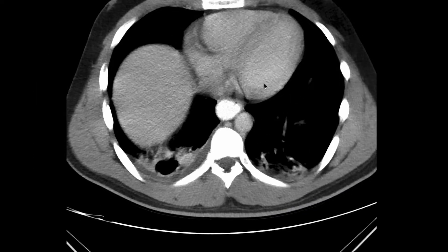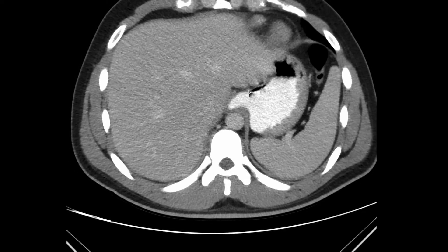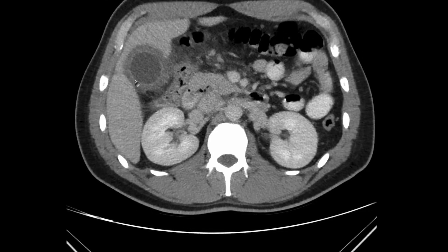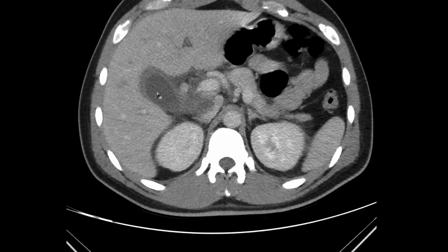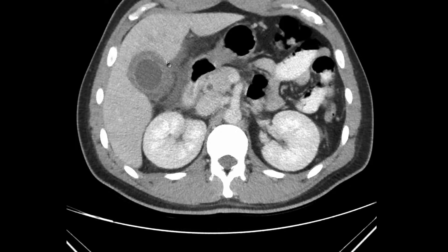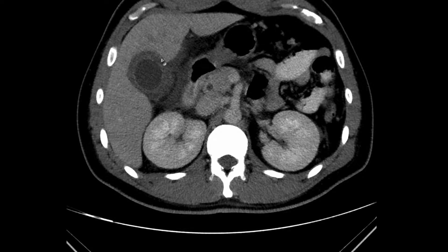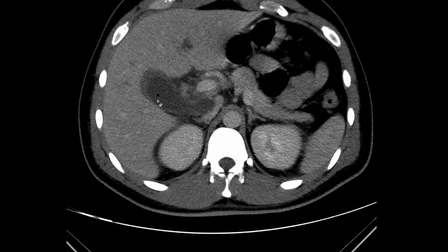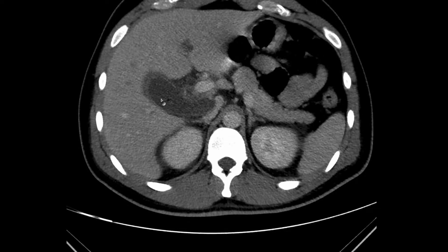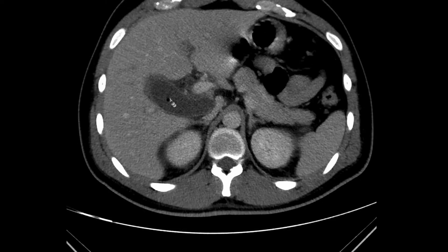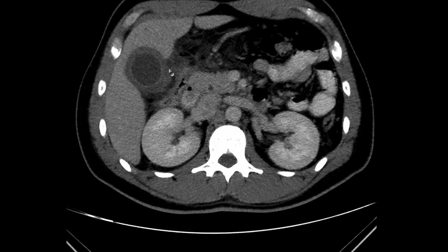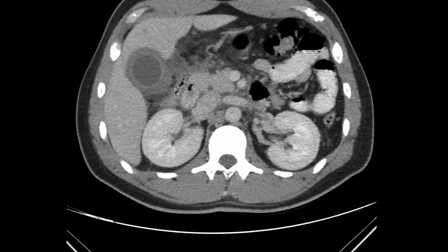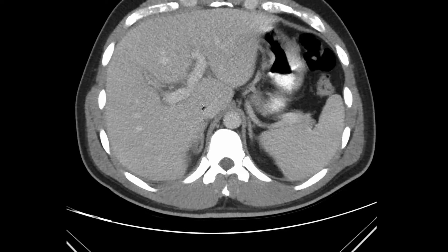Let's look at another case. This patient is a 37-year-old presenting with right upper quadrant pain. As we scroll down, we can see a pear-shaped structure in the gallbladder fossa, which is the gallbladder. The gallbladder wall is markedly thickened. Contained within the gallbladder, there are multiple locules of gas, which indicate gas-containing gallstones. The gallbladder is moderately distended and the surrounding fat is fuzzy, indicating stranding. Therefore, this patient has acute cholecystitis.